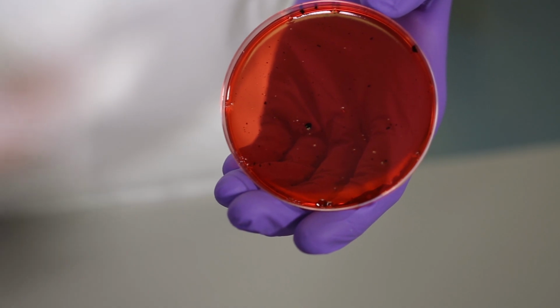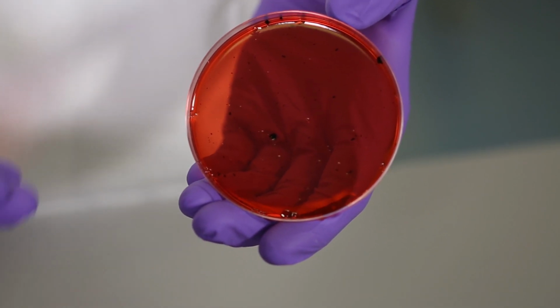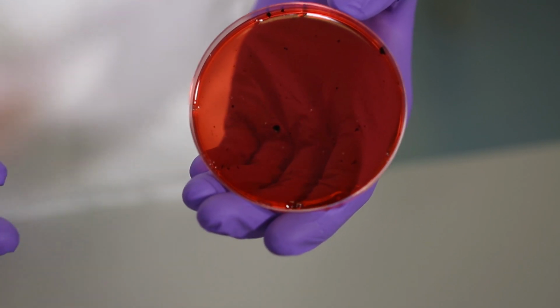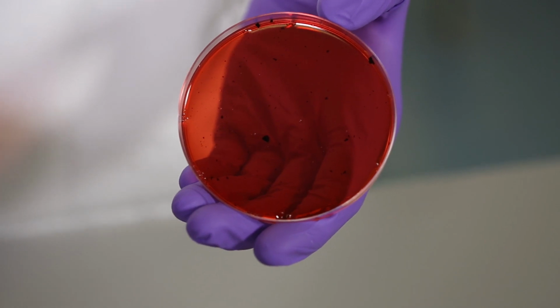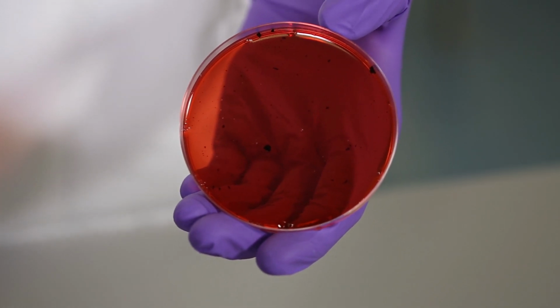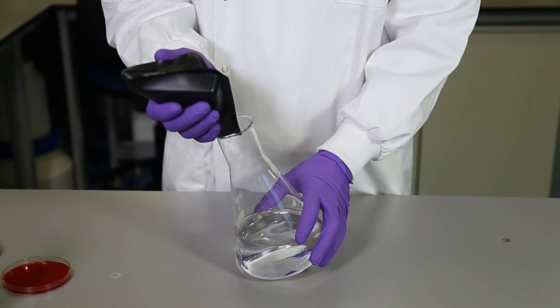This is especially a problem for this agar, as the target organism, salmonella, grows as black colonies on the agar. Thus, burnt particles could be misinterpreted for a pathogen. This is an extreme level of burning, and users may normally only see a couple of charred particles. One way this can occur is the improper dissolution of powder.